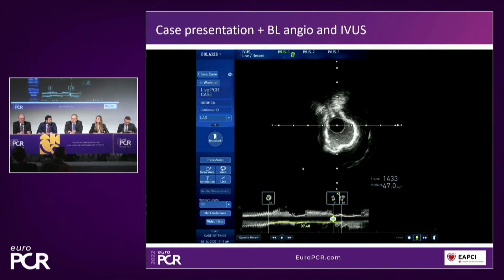What you're saying is particularly important, especially because here the risk is that we end up with a full metal jacket. So it's key to understand where is the starting point, but it's extremely important to understand and to know upfront where we are ending this stenting procedure, which is equally important. Why don't we go back to London and see what they decided to do?